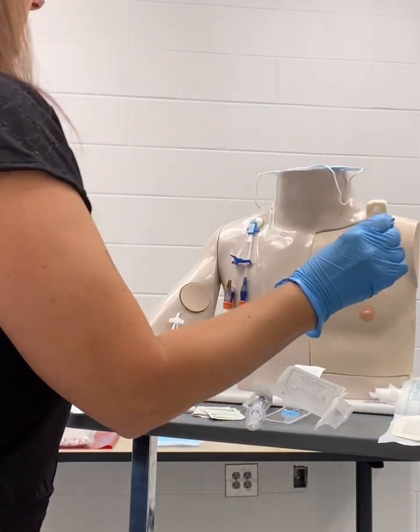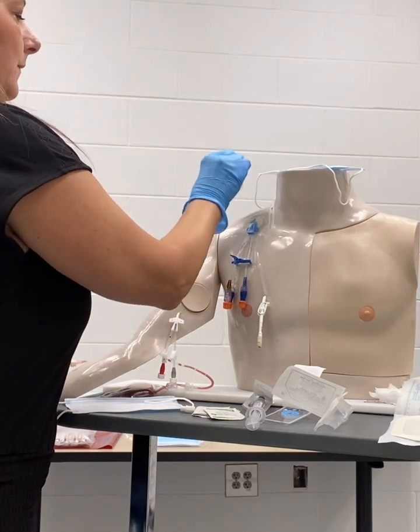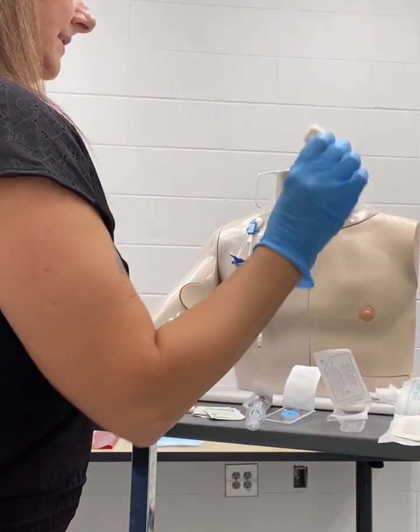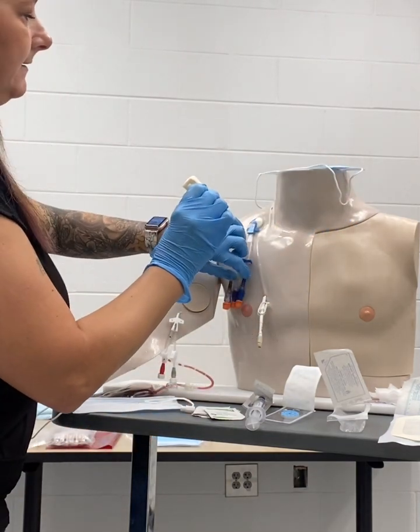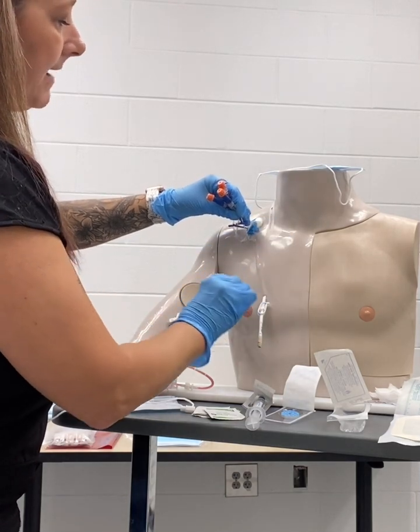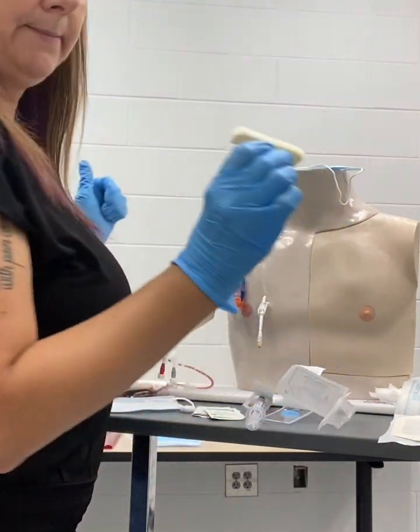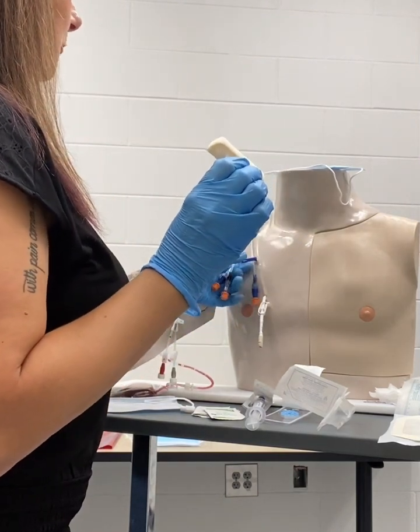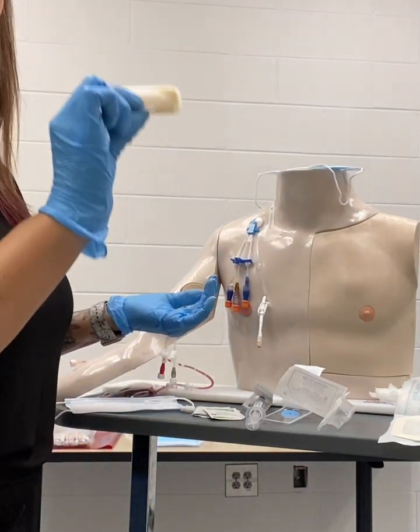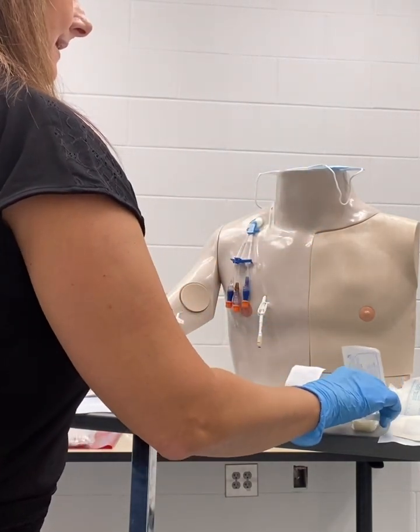I'm going to pop this, and I'm going to cleanse the site in an upward circular motion like a rainbow, and then I'm going to toss this. I'm going to get my second chloroprep with the sterile hand, and I'm going to clean underneath the site going in a circular motion in an upside-down rainbow, and toss this. Next, I get my last chloroprep, and I'm going to use this one to clean the lumens from the proximal to the distal side, all the way down in one smooth swipe. I will discard this and allow it to dry.